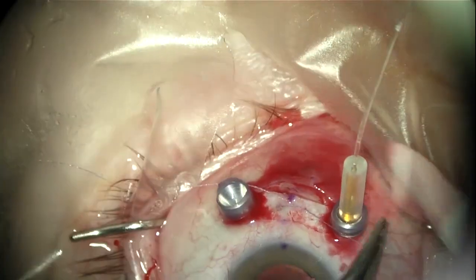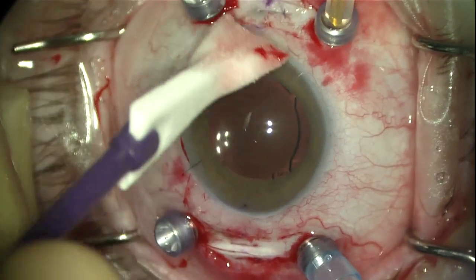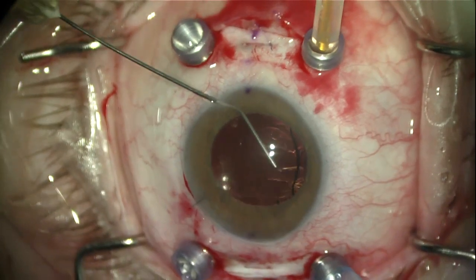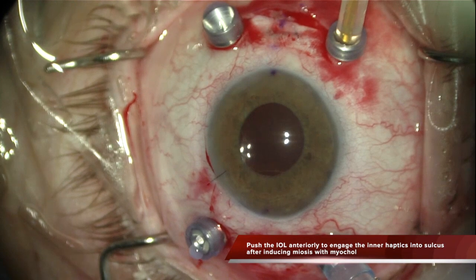Using the other kind of scleral tunnel that I published previously, the risk of extrusion is high. But with this kind of tunnel, the risk is very low — the same as with scleral flaps.